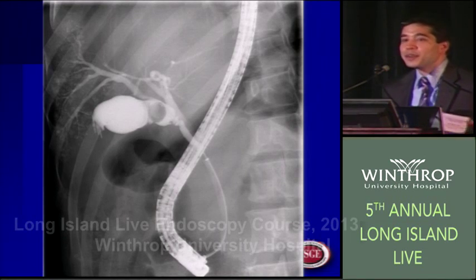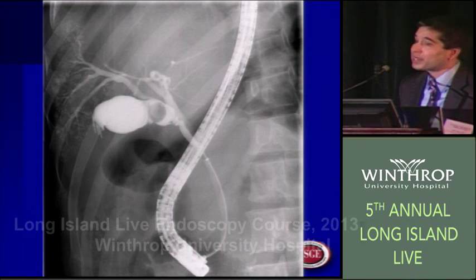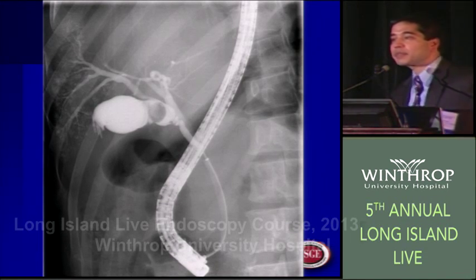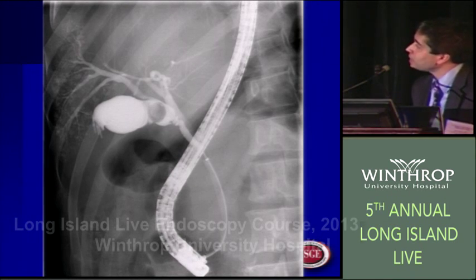So you think, okay, this lady's got a gallbladder stone. They just need a cholecystectomy. But if you look real close, there's surgical clips there already. I don't know if you've encountered this, but occasionally when patients come in with acute cholecystitis or significant inflammation in the gallbladder fossa, they're doing these laparoscopically, obviously. But in some cases, you can have an incomplete cholecystectomy. And that's exactly what was noted here.